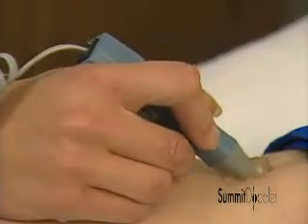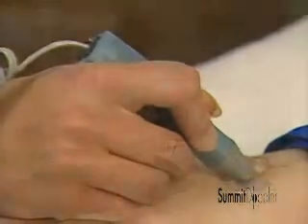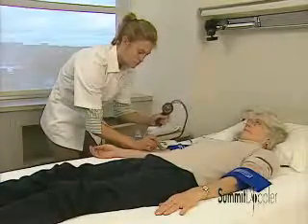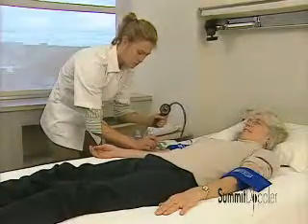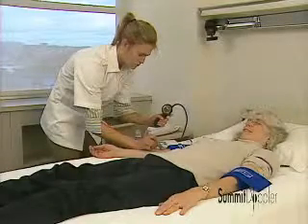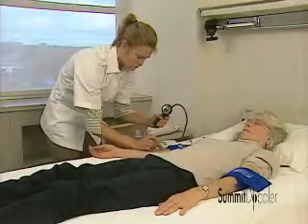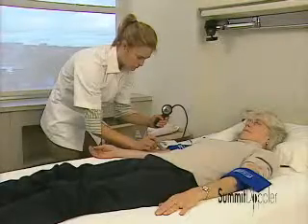Venous flow will not interfere with the blood pressure measurement because the vein will occlude at a relatively low pressure as you inflate the cuff. Before inflating the cuff, be sure to brace your probe hand. Inflate the cuff quickly, stopping about 20 millimeters of mercury above the occlusion pressure.